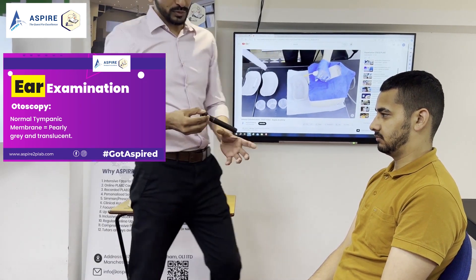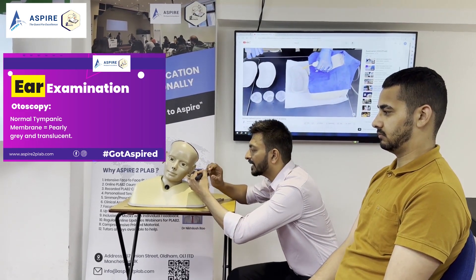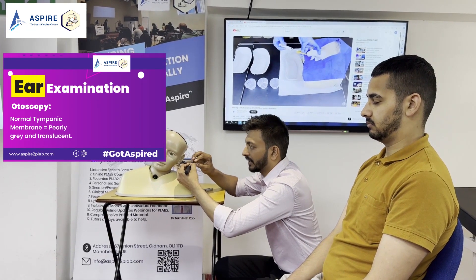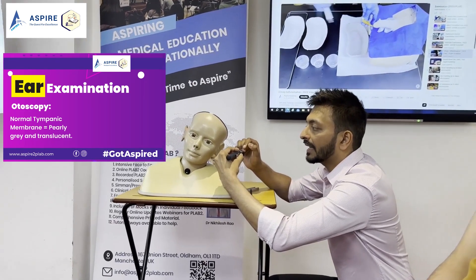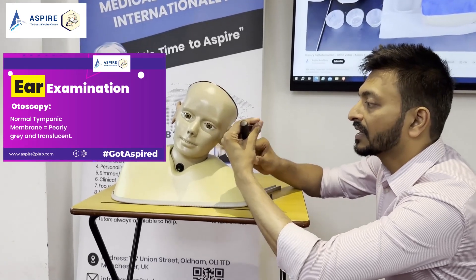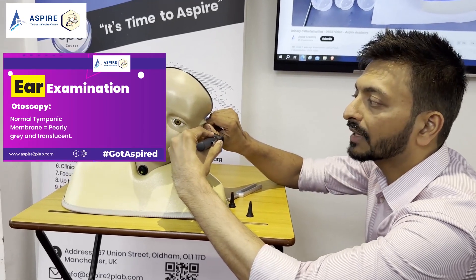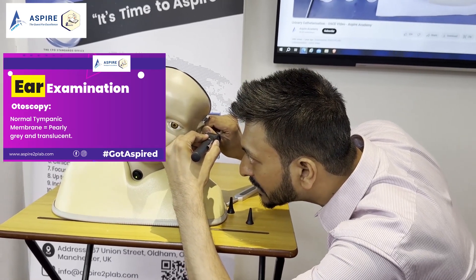So what do we have to do for the examination? First, we shine the light in the external auditory canal and look for any foreign body. This is how you hold the otoscope — like a pen — making sure the little finger is on the patient's cheek. With the other hand, make sure you pull the pinna upward and backward and look at what you see in the ear.